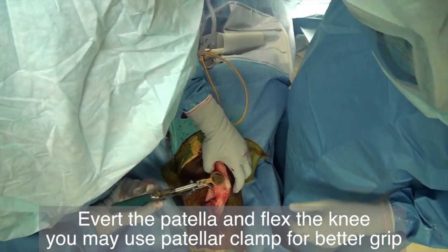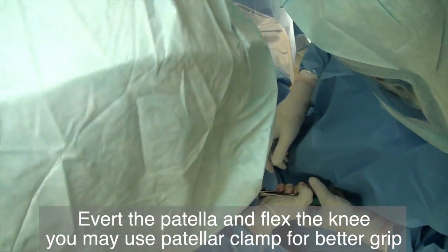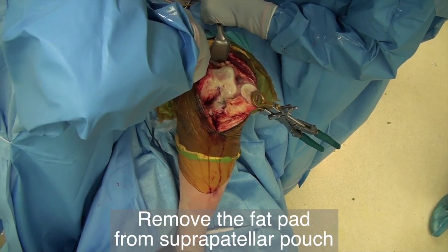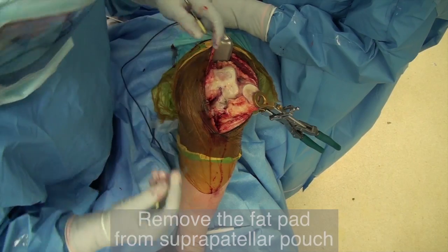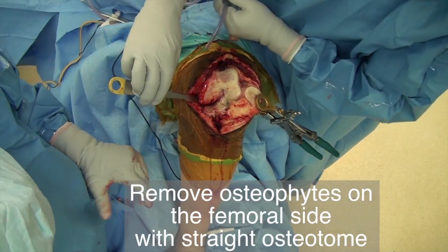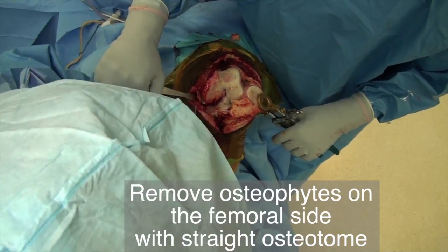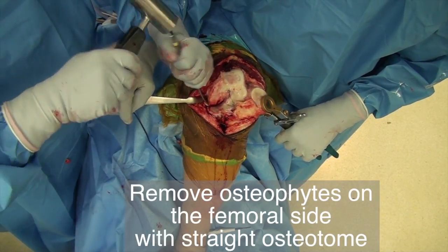We like to use the patellar clamp for a better grip to evert the patella; however, you must pay close attention not to tear the patella tendon. Place the Richardson retractor in the suprapatellar pouch to clean the fat pad. Place the Hohmann retractor on the medial side of the femur protecting the MCL, then remove the osteophyte on the medial side of the knee with the straight ¾ inch osteotome. Use the ¼ inch curved osteotome to remove the osteophyte on the posterior medial femur.